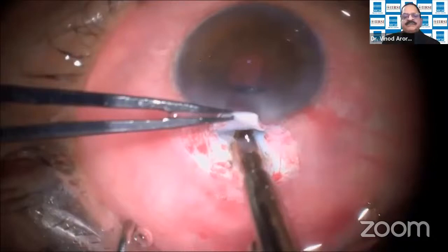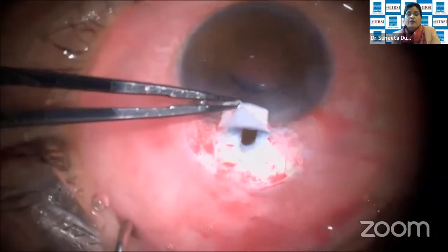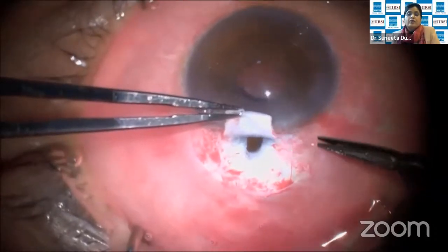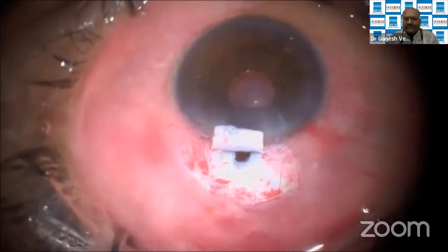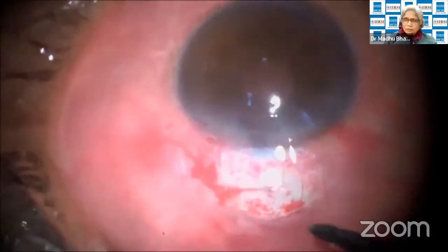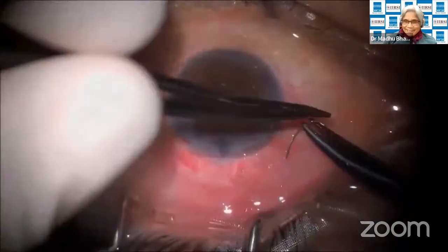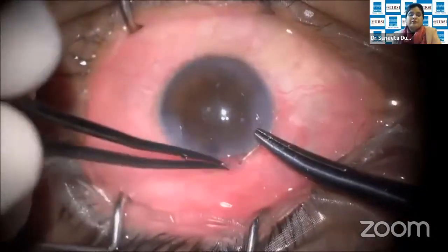So what is the preferred size of this ostium opening? It's 1.5 by 1.5 millimeter. Yes, provided you give some space between the edge of the ostium and the edge of the flap. Right, 1 millimeter space. So I think it depends on the size of your scleral flap. If you have made a very large scleral flap, then you have to make a large sclerostomy. But as I rightly said, it has to be covered on either side by the scleral flap by at least 1 millimeter. Titration, like chemistry titration. They have to be titrated with the size of each other. So I think the previous video.